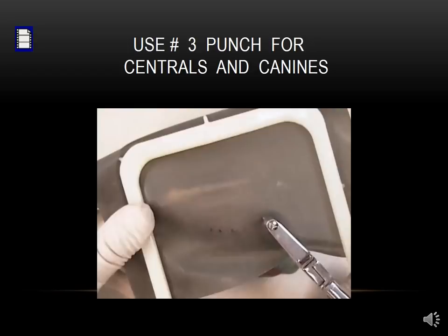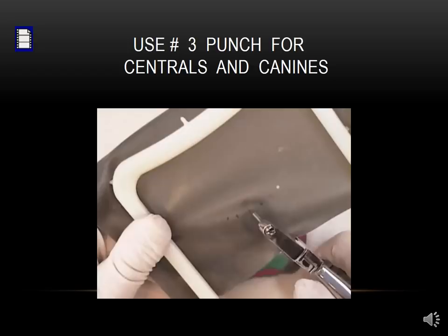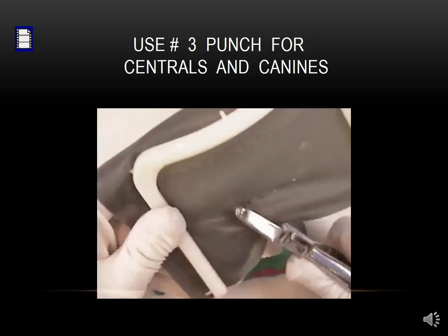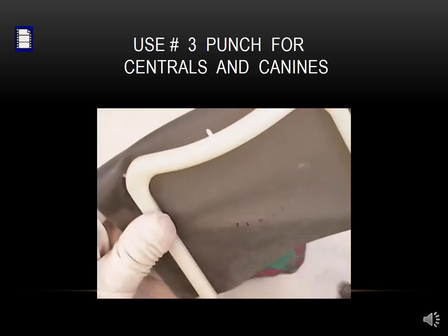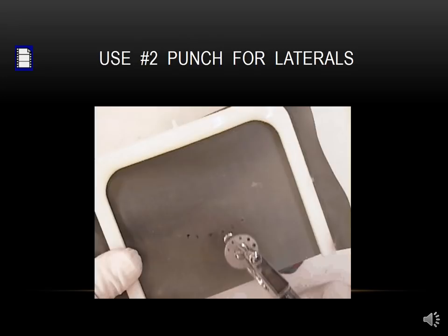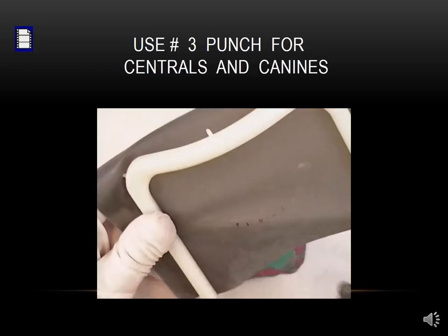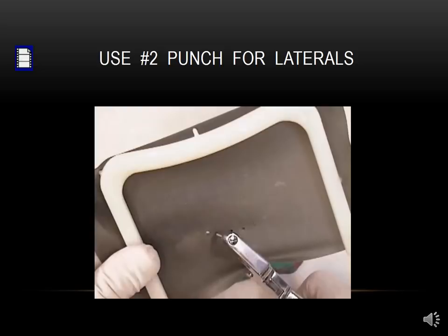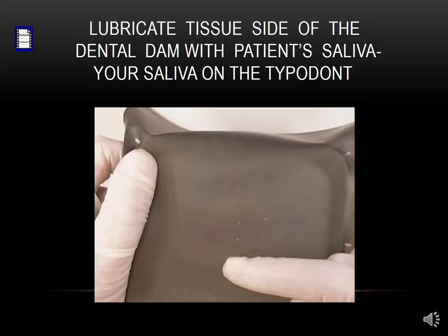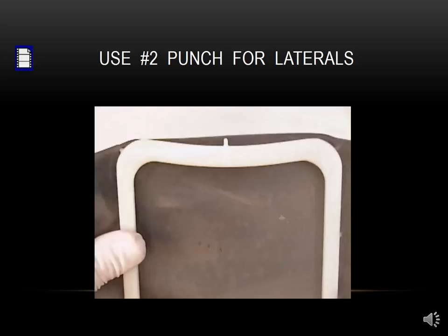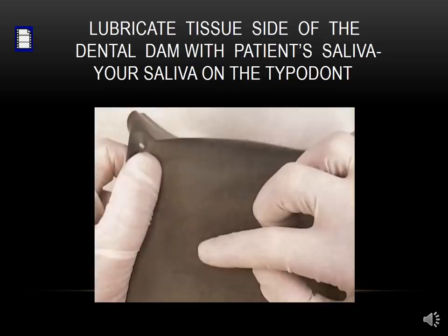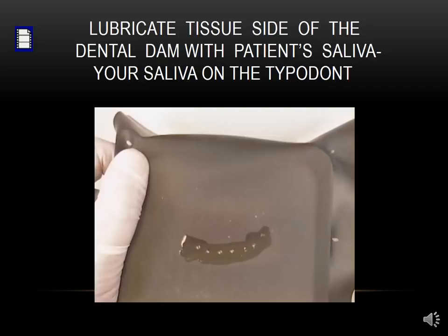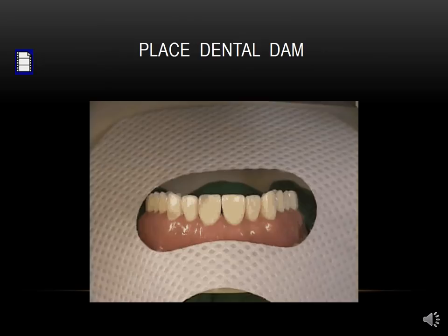On anterior teeth, I recommend a number three hole punch for the centrals and canines, then go to a number two, which is smaller, for the laterals. This is a heavy gauge rubber dam, which is what we want to use when doing diastema closure so it retracts the tissue. Then we lubricate the tissue side of the dental dam with the patient's saliva — if you're a dental student working on a typodont, it's okay to use your own. Then we place the dental dam.